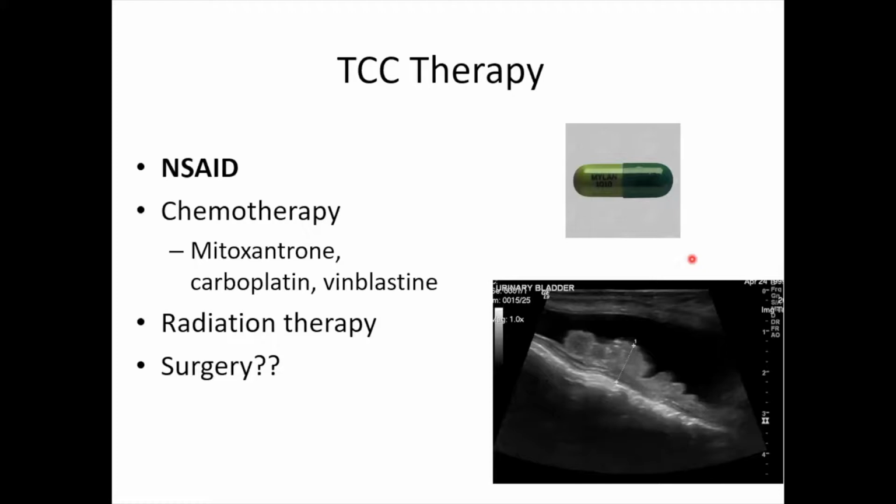Absolutely. So the urine actually doesn't need to be refrigerated. And that's because there is a preservative in the cup that you will be provided with for urine collection. So the reason we want clients to use a different cup is because we don't want the preservative to spill out. And so we have them keep the collection cup separate from the test cup. And so when they go outside to collect urine, we ask them to collect in that one and then gently pour it into the cup with the preservative in it. And because it has the preservative, it does not need to be refrigerated.